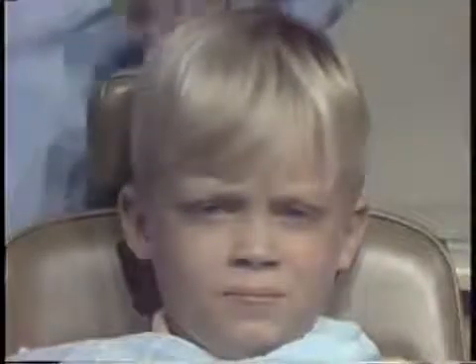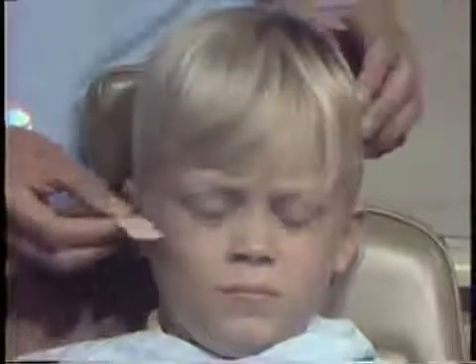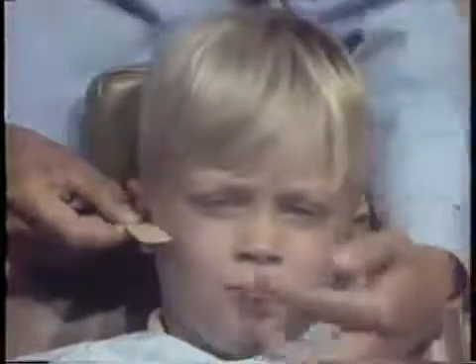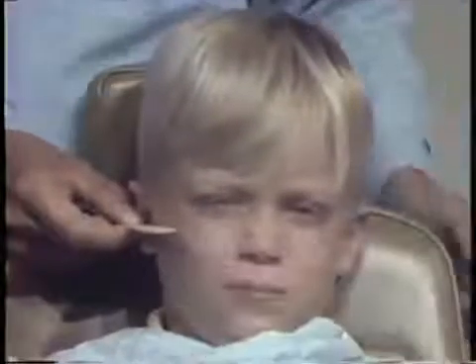Let's get busy and do the facial form analysis first. The first step in the facial form analysis is to put the patient in the standard position. The first part of that is to put Frankfurt horizontal parallel to the floor. Jeff is of normal size, but with these large chairs it's very difficult to position the head with the headrest, so you'll often have to manipulate the child's head yourself. The chair should be fully upright with the seat all the way forward.